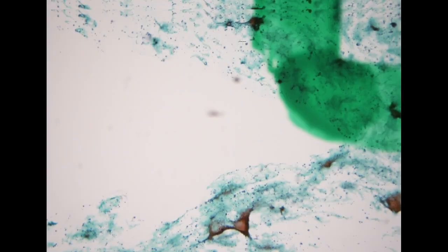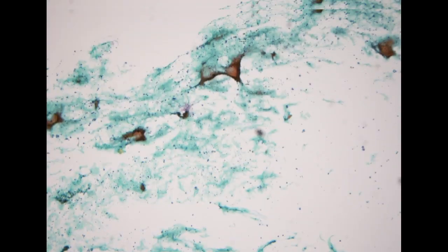So the second specimen is also an ascites specimen. The patient went to our emergency department. He is a 72-year-old male. In this specimen, we see some proteinaceous background material. So it's relatively unusual to see this.